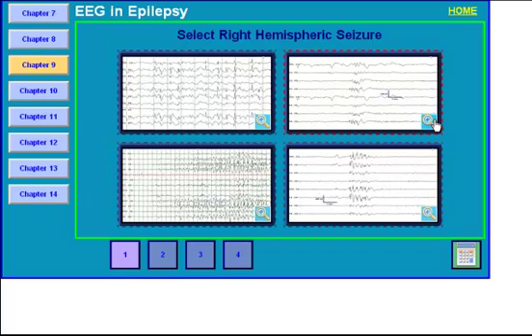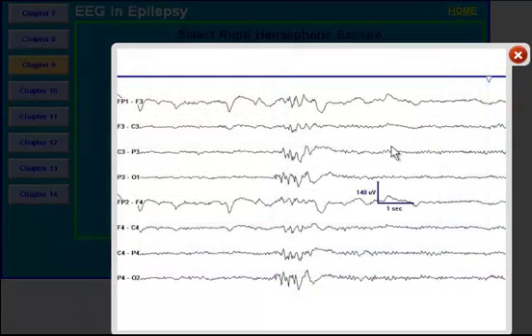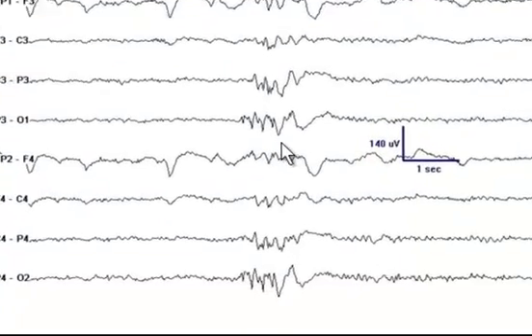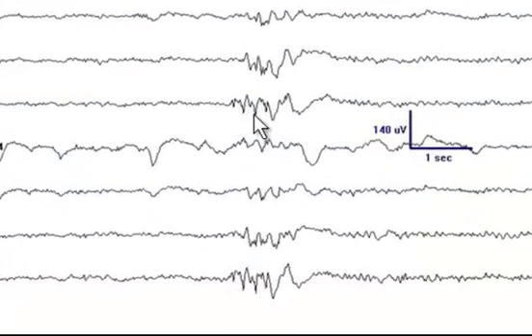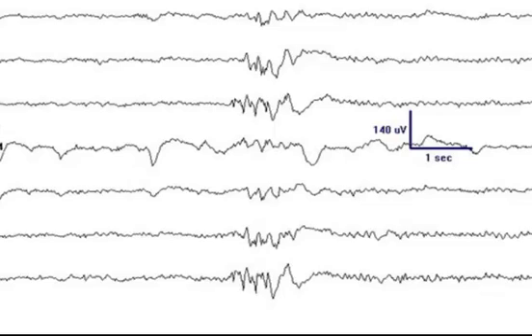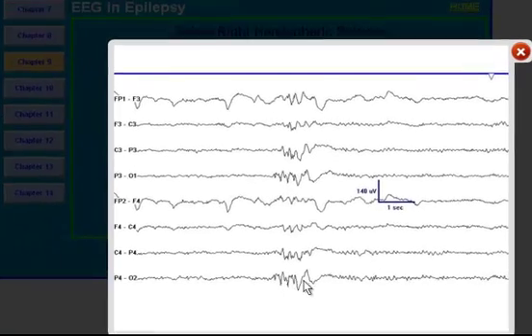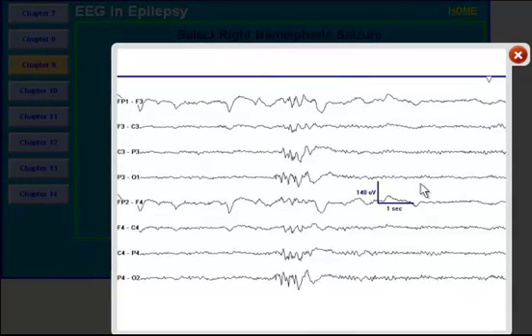What about this? Could this be a seizure? Well, it is not. You see a paroxysmal discharge with sharp activity in the occipital head region at P3O1 channel. The maximal negativity is at O1. So you don't see a seizure. There is no evolution in frequency or amplitude.